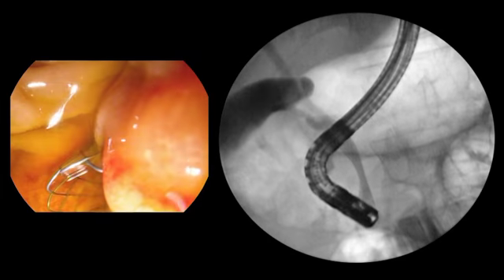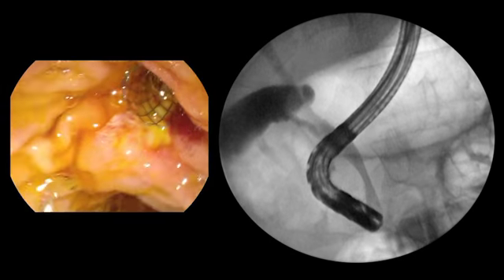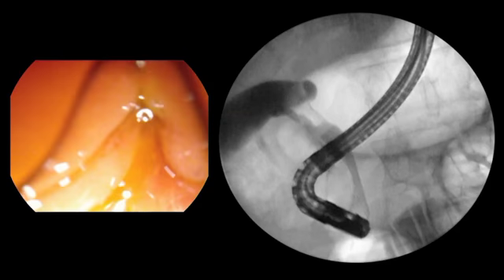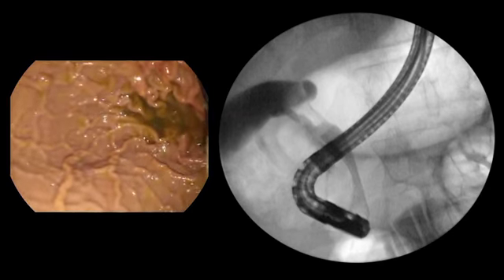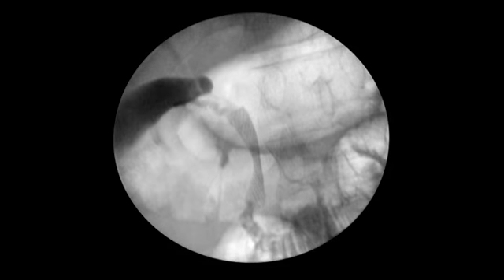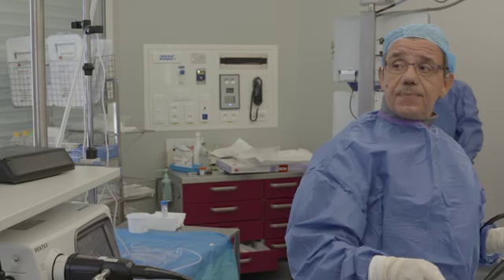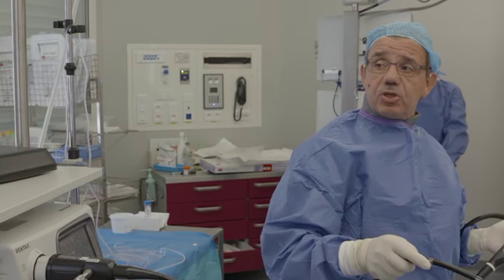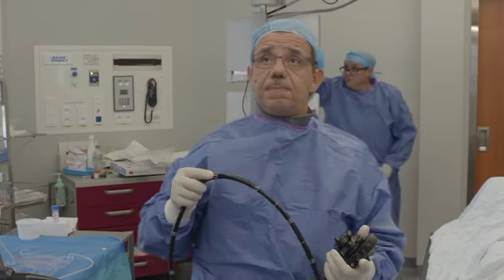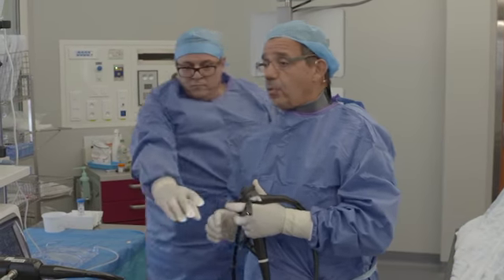X-ray, last picture. And now a photo without the scope of the X-ray. X-ray, please. Okay. And now the procedure is finished. And when the jaundice disappears, this patient will be operated with a Whipple resection.